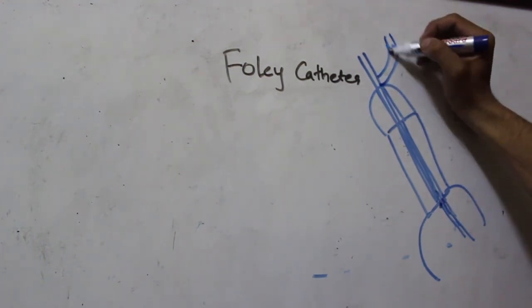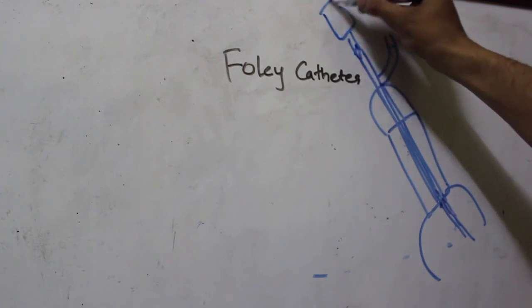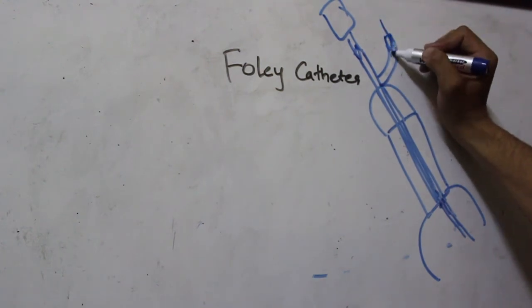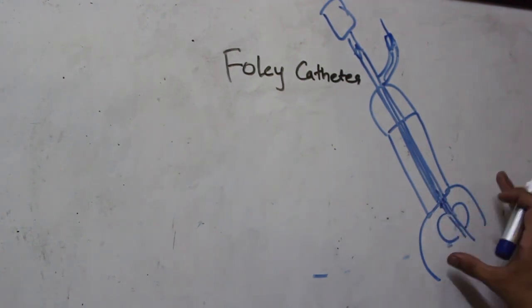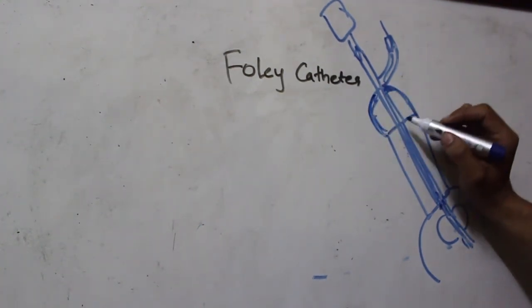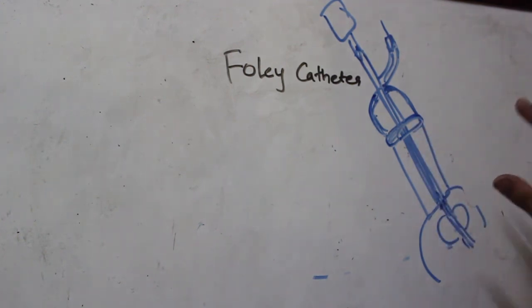The urine will start coming out of the discharge tube, and you have to connect this with a urobag to collect the urine. Now after the urine has come out, you have to insert distilled water through this tube so that the balloon can be dilated and placed inside the bladder so that it does not come out. After this has been done, you have to place the foreskin back so as to prevent the paraphimosis that you induce if you keep the foreskin retracted.